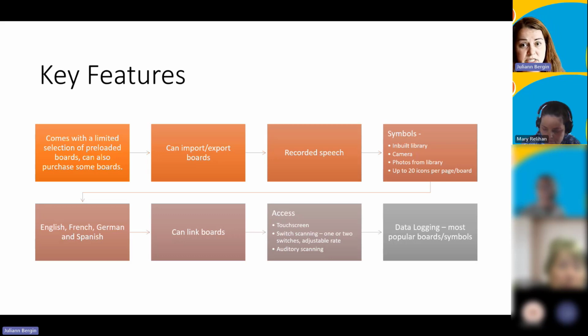It uses recorded speech, so for the demos today I'm using my voice, but take into account who is the person that's going to be using the system and maybe try to find a voice that might match theirs. So for example, I would not use my voice for an 8-year-old boy. I would try and find somebody male at the very least, preferably a male child, but I know sometimes we're restricted in what we can source in the moment.